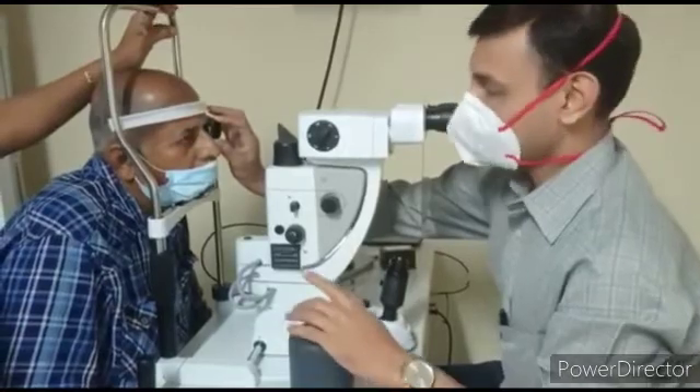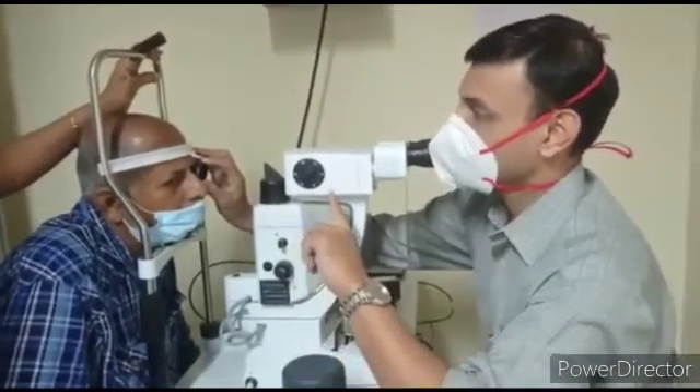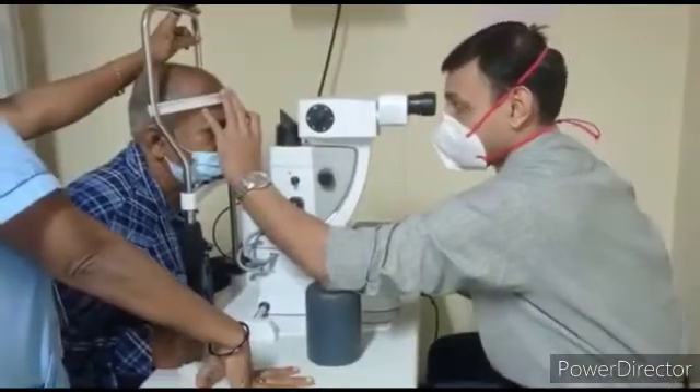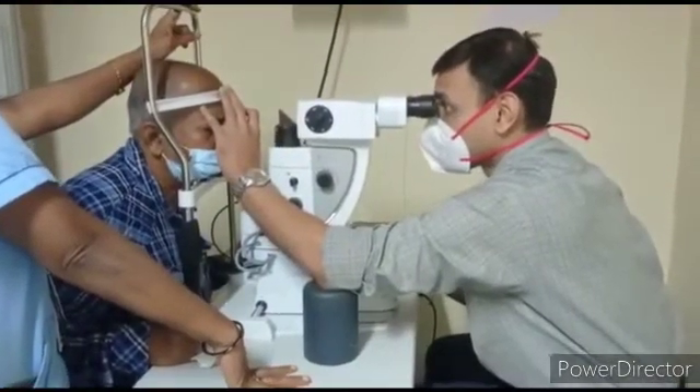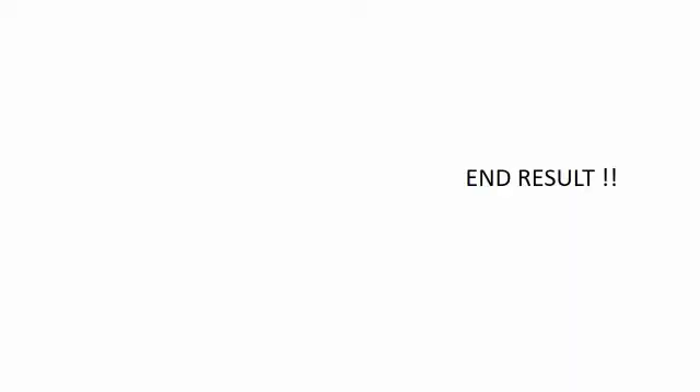During the procedure, the patient will see repeated light flashes and also experience stinging pain at some sensitive areas. The whole procedure is over in a short time. There will be some residual pain at the end of the procedure, for which we give painkiller drops and tablets.